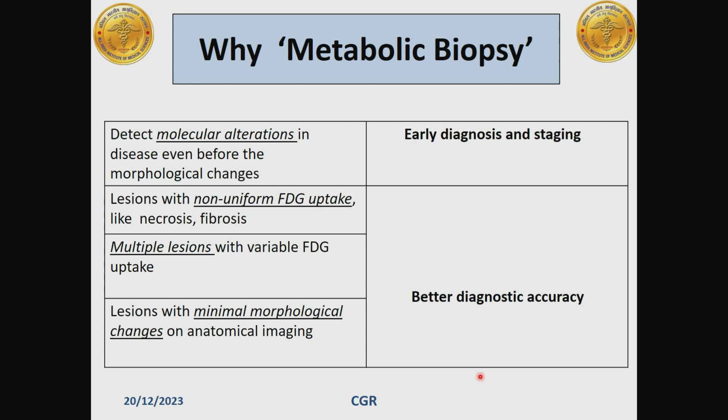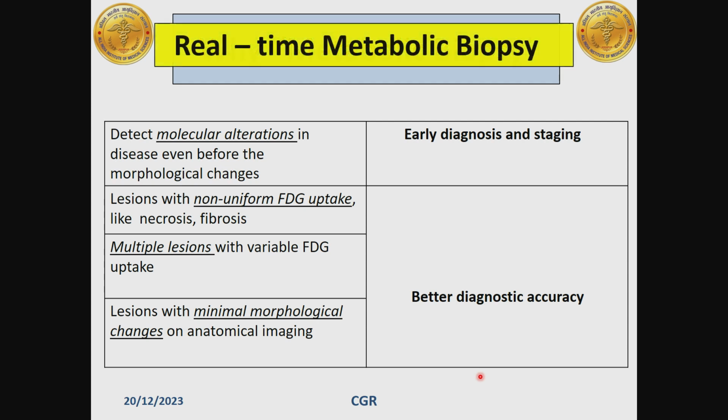Now, till now I talked about the metabolic biopsy, but from now on what I'll say will be a real-time metabolic biopsy, that is which we are doing in our institute. With the real-time or the intra-procedural metabolic biopsy, I mean to say that the FDG PET-CT is done just prior to the procedure, and the entire procedure of the biopsy or this intervention is planned based upon this latest PET-CT, and the accuracy of this procedure is also checked simultaneously with the fused PET-CT images. The entire procedure I'll be telling in some time.